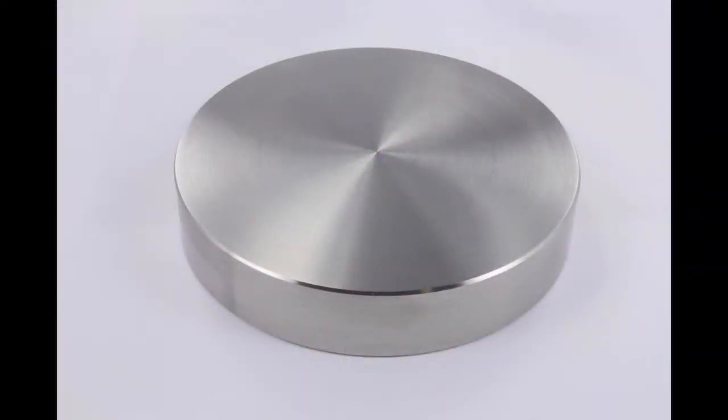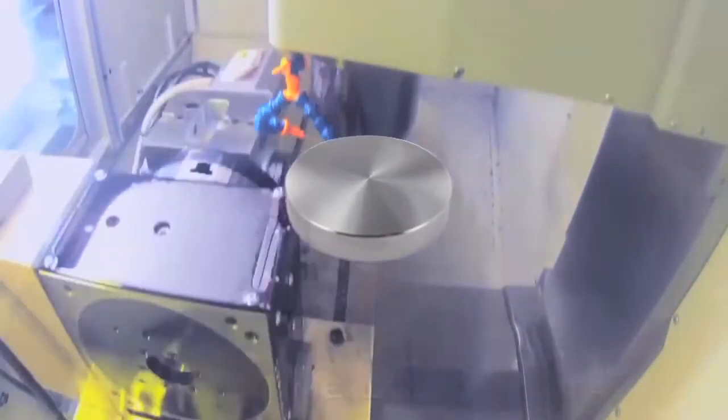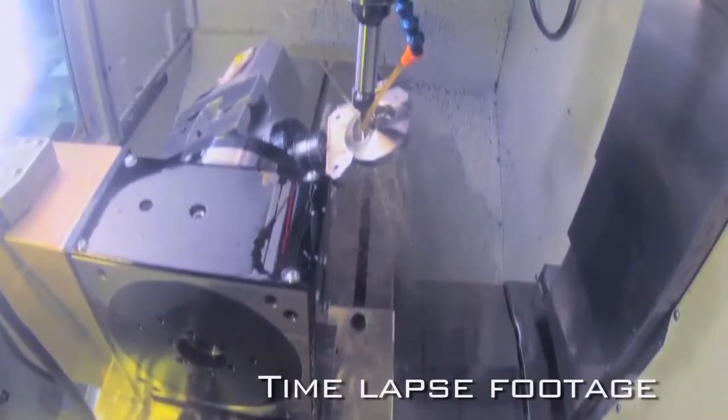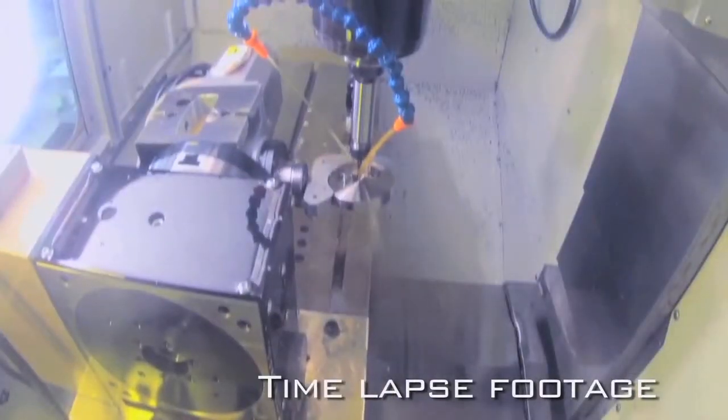A physical titanium blank is then attached to a milling fixture and placed within the highly precise 5-axis mill. Actual milling time varies, but generally requires just a few hours.